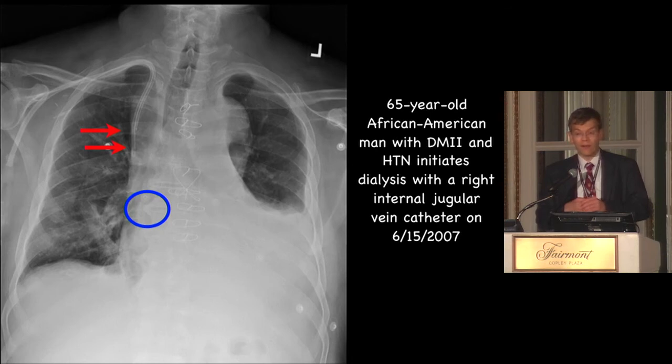And you want it there on the x-ray because the space is large, and you can have 400 ml of blood going into the catheter and 400 ml of blood going out of the catheter without doing too much endothelial injury on the vein and getting low recirculation.